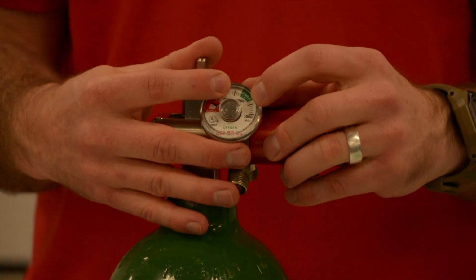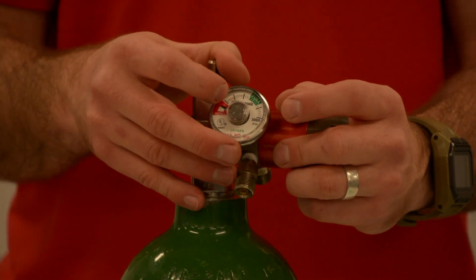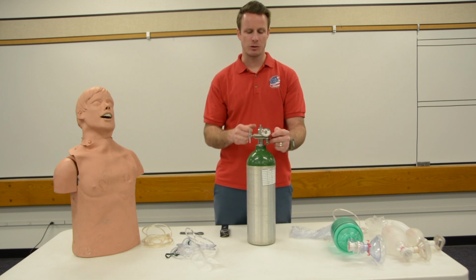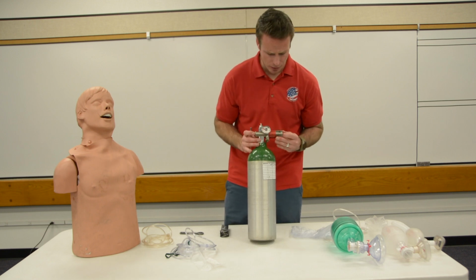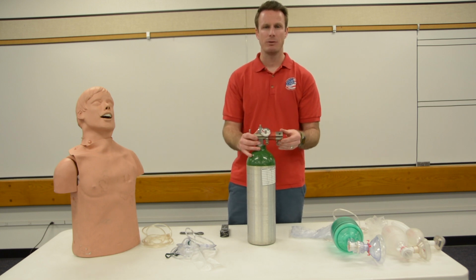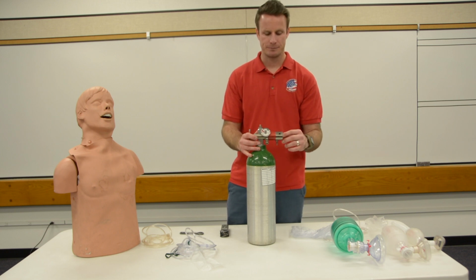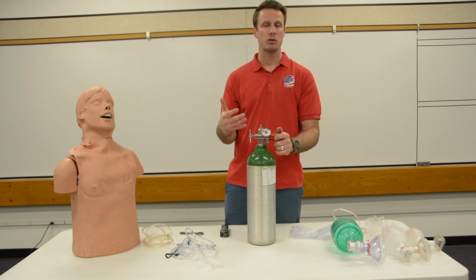So a full tank will be read at 2,000 psi, and then an empty tank is considered anything 500 psi and below. If it's lower than 500 psi, we should be changing that out because it's probably not going to last us a whole other call. From there, I also want to take a look at my flow rate, and I can find that right here. I can actually adjust it to make sure that I have oxygen coming out, and then the oxygen should be coming out right here at this very bottom port. Now that I have all of these things done, my oxygen tank is set up, it's ready to be used on my next call, and I can go ahead and administer oxygen to my patient.